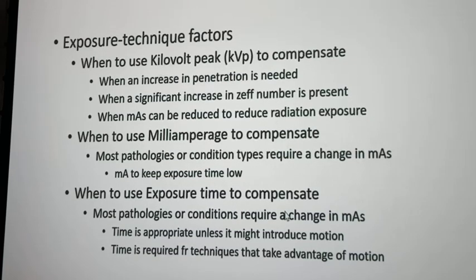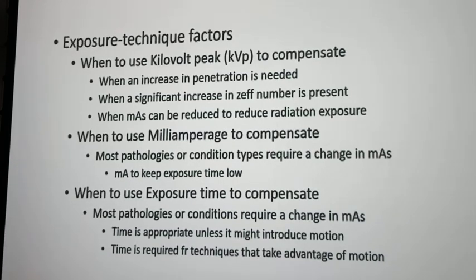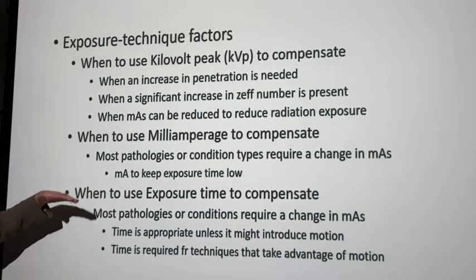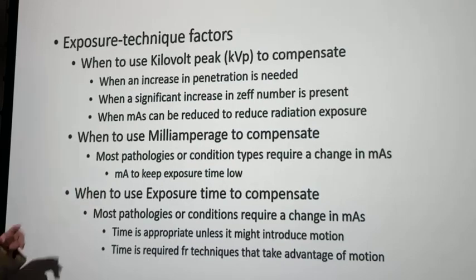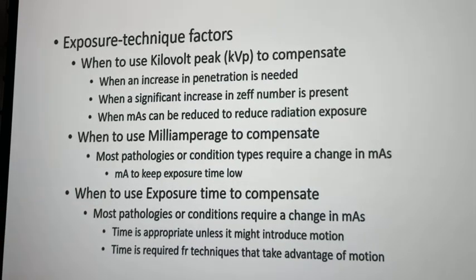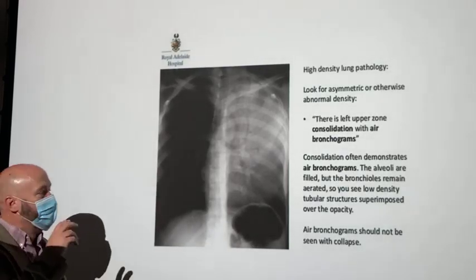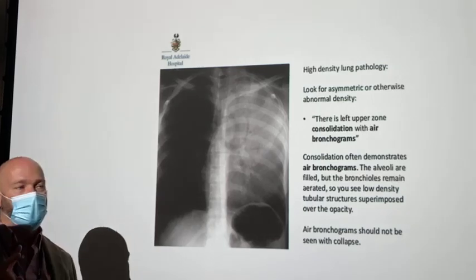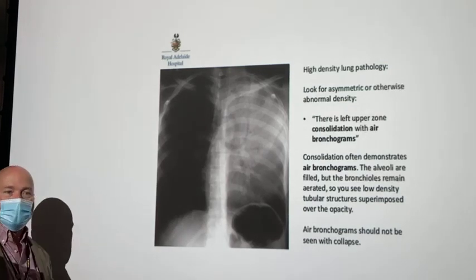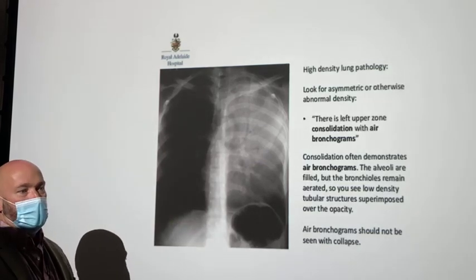If you're at a total loss for a technique, and you're phototiming, I'm sorry, it's exposure time, but if you're phototiming, you've got two possible ways that you can adjust for the technique so that you can get this long time, okay?